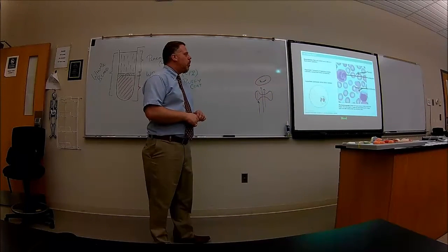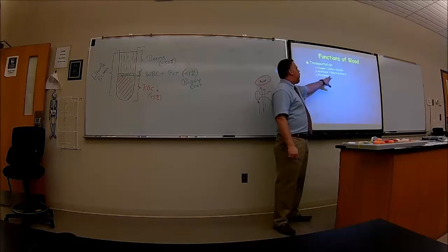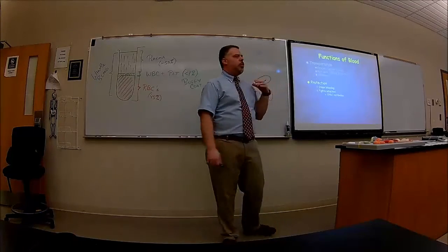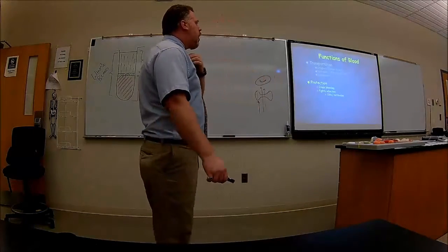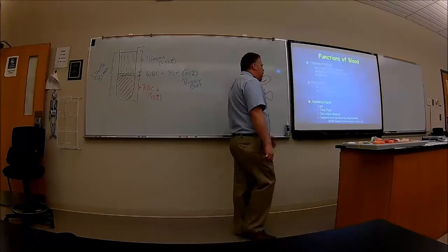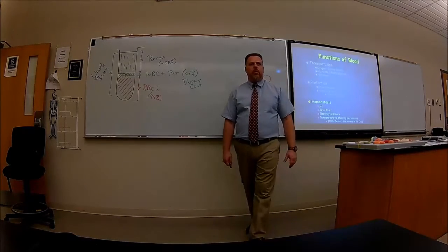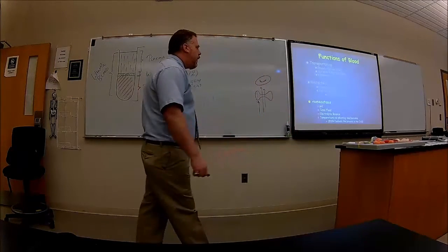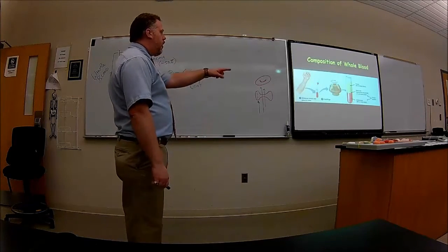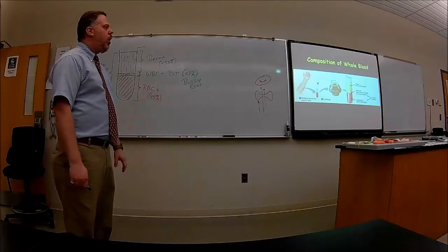Okay? So functions of blood, it's going to transport our hormones, nutrients, waste products, oxygen and carbon dioxide. It's going to protect by stopping our bleeding, fights infections, and it's also going to help with homeostasis, keep an electrolyte balance to where it should be in homeostasis, right? Total fluid pH. So like I said, they're showing the same thing, going through a centrifuge, breaking it all up.